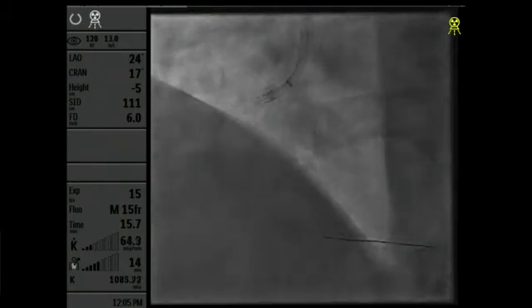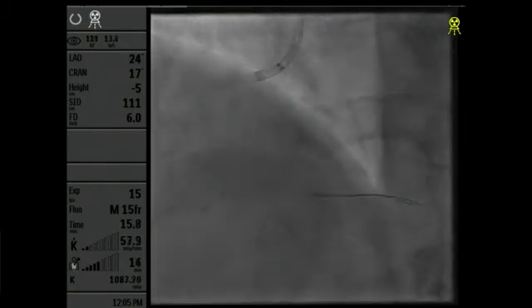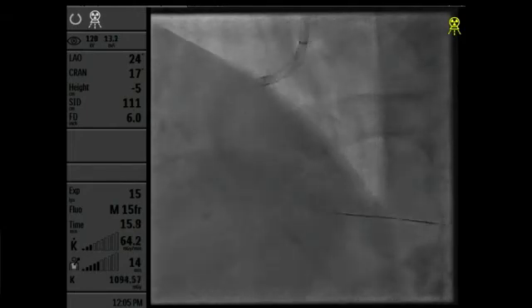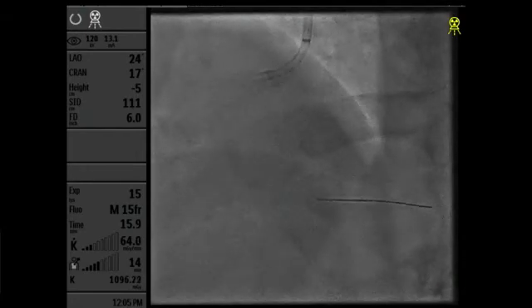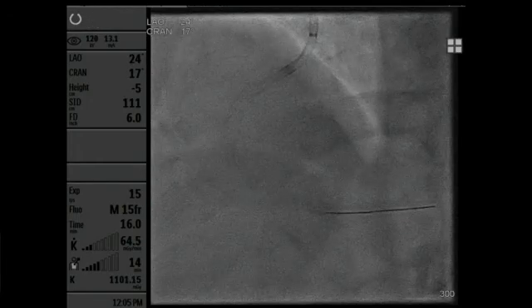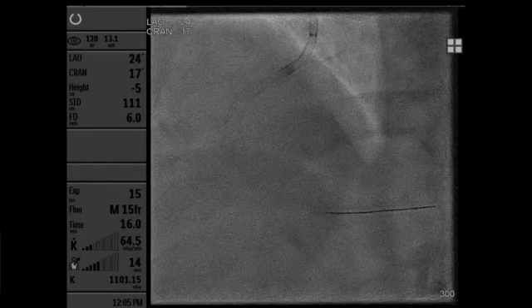A lot of CSI users like Dr. Schlomfitz will tell you that he's very comfortable with that. And those who are doing a lot of rotational atherectomy like Maurice will say that would be my first choice. And those who have not done many of those before were leaning more toward IVL first. But again, what is better? We're not going to have any head-to-head trials soon to compare and contrast.